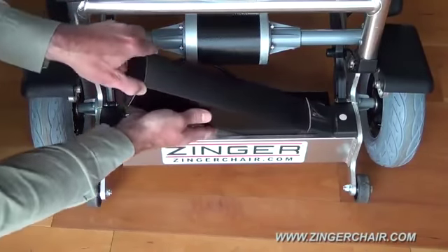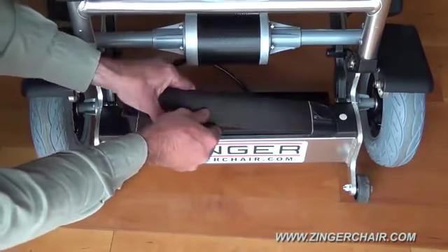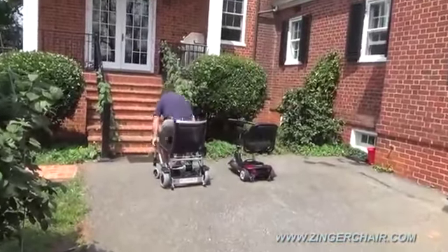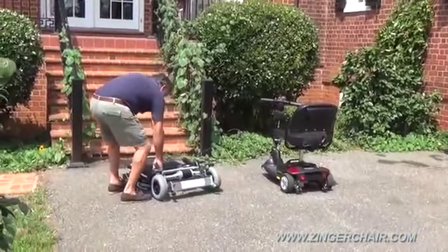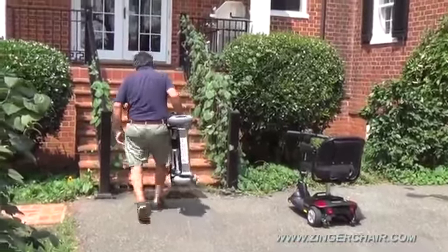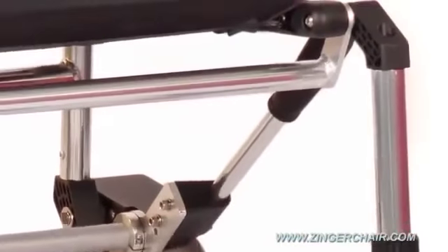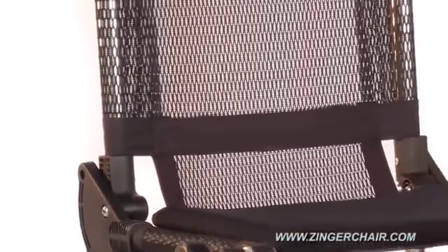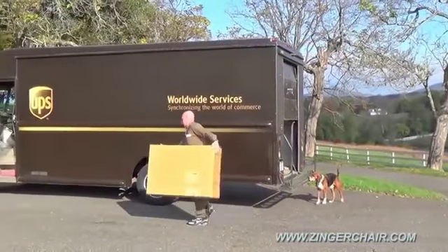Each Zinger comes with a lightweight lithium-ion battery pack, sealed in an anodized aluminum housing, which removes for charging in or out of the chair. The Zinger has a range of 8 miles, a top speed of 6 miles per hour, can climb up to 8 degrees — that's 3 degrees more than any wheelchair ramp — and has a maximum capacity of 250 pounds. It's precision built using 6061 aluminum tubing, high-strength composite hinge joints, and a cool breathable nylon mesh seat. The Zinger comes to your door fully assembled in one standard size box.